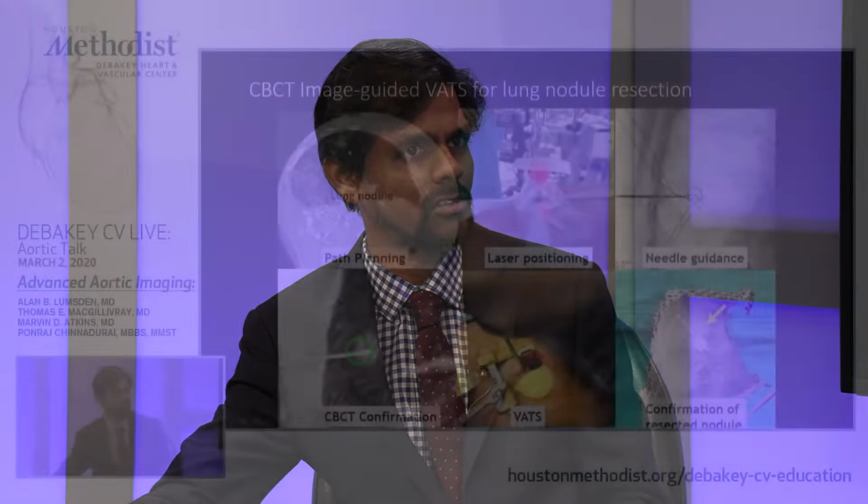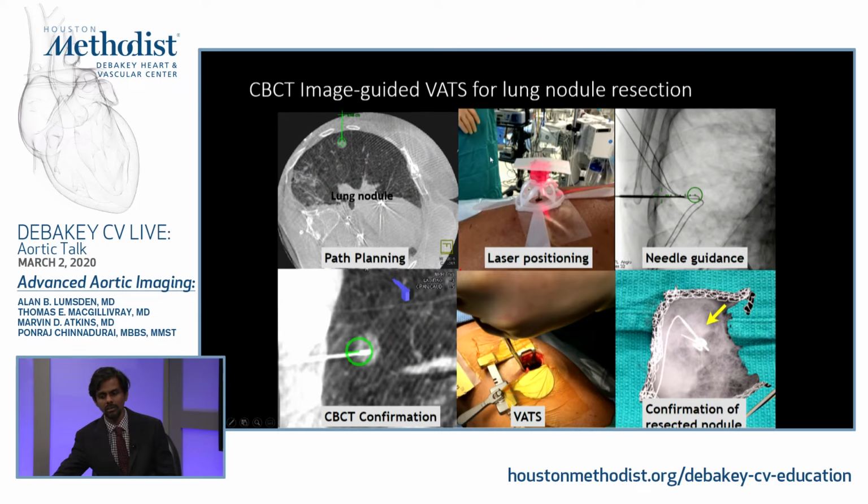Absolutely. And switching gears towards thoracic surgery, you can not just do vascular procedures, you can also target a lung nodule. This is all done in one setting with the patient coming directly to the hybrid OR. Most patients often have a CT because of the CT screening protocols now active for lung cancer. So once you know the patient has a nodule, the patient can come directly to the OR.